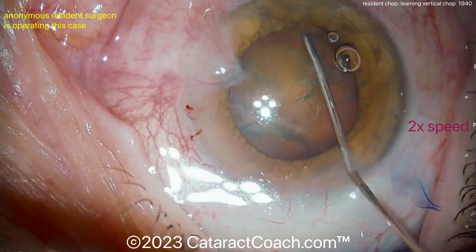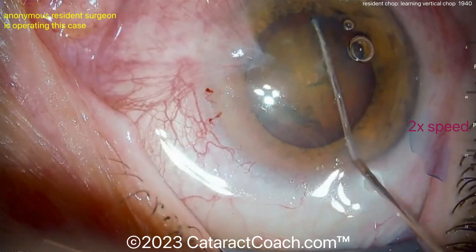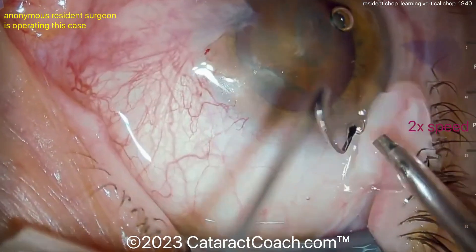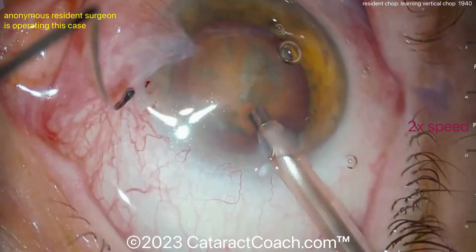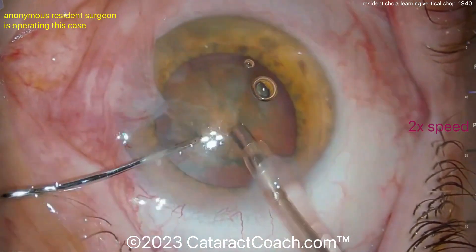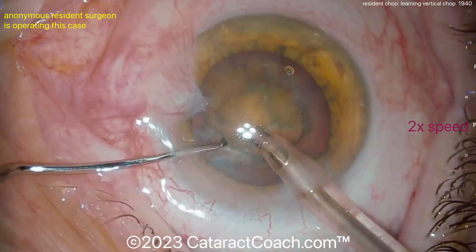The eye is in pretty reasonable position. Not my favorite draping here — look at all the particulate matter in the tear film. You can see that the eyelid margin is not sequestered; there's no plastic drape over it. So all the secretions from those eyelid glands are just coming right into our tear film. Not ideal.